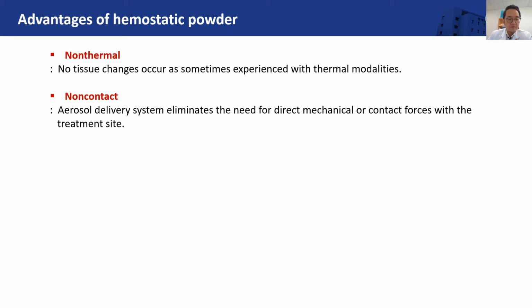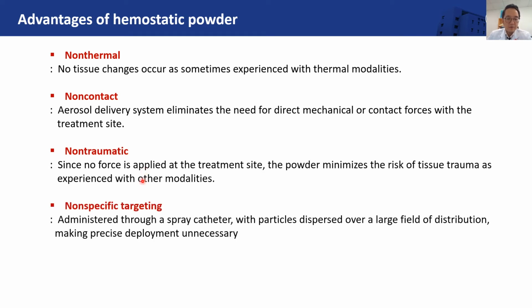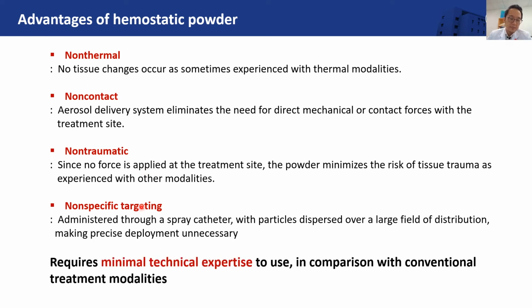There are several advantages of hemostatic powder, which is non-thermal, non-contact, and also non-traumatic, and the final one is non-specific targeting. To summarize these characteristics, we can say that this kind of hemostatic modality requires very minimal technical expertise to use in comparison with conventional therapy.